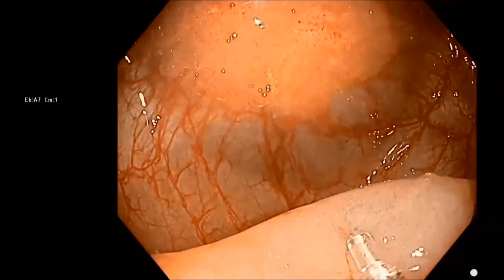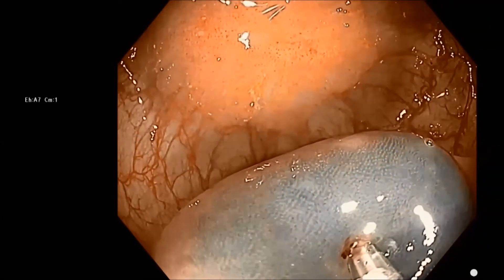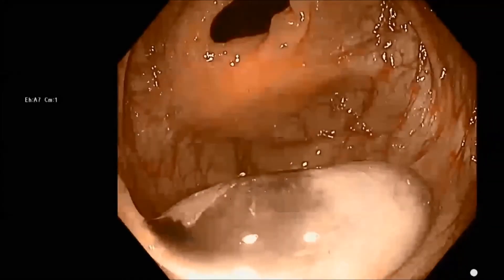This will keep any tattoo from getting under the lesion and inducing submucosal fibrosis. Then we take a photograph of the tattoo and the lesion, and in the report designate where we put the tattoo relative to the lesion.